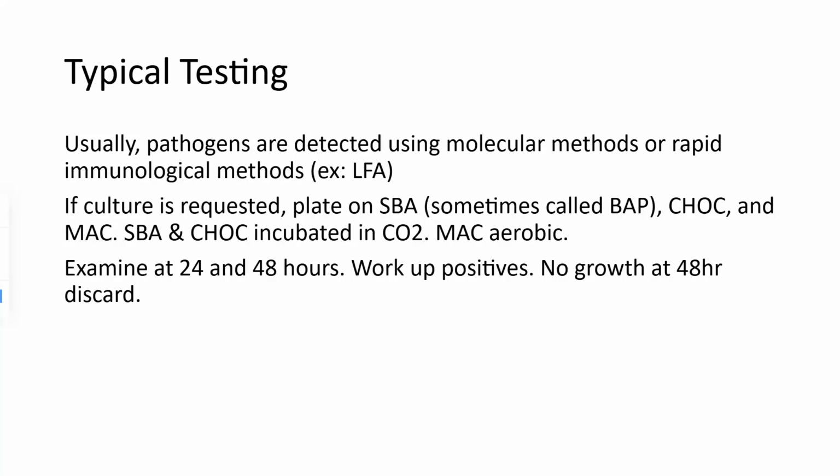So typical testing, usually pathogens are detected using molecular methods or rapid immunological methods. So culture is pretty rare. A lot of times when we're looking at respiratory samples, we're looking for respiratory viruses, which mostly can be identified using molecular techniques, or we're looking for a strep throat type infection, and that is diagnosed by lateral flow assay, or LFA. We have those rapid strep tests where you put the sample in and then you wash it through and it goes past, and there's capture antibodies that will capture the surface antigens if strep is present, causing a color change on the test strip. So that type of lateral flow assay would be performed.